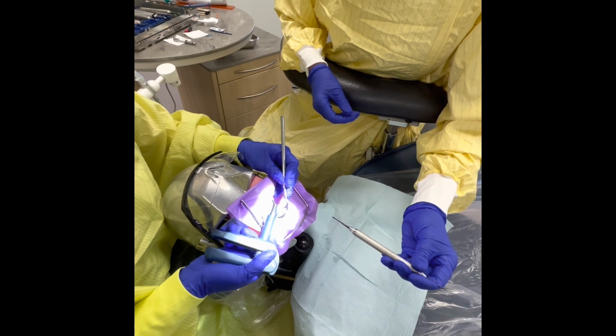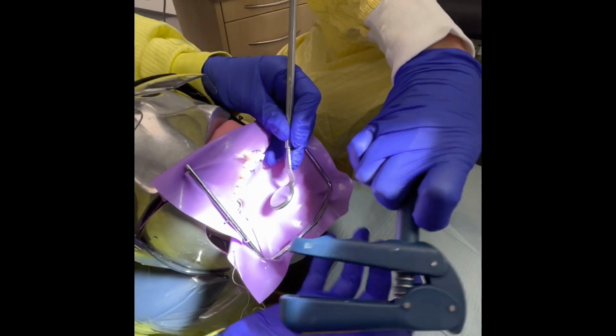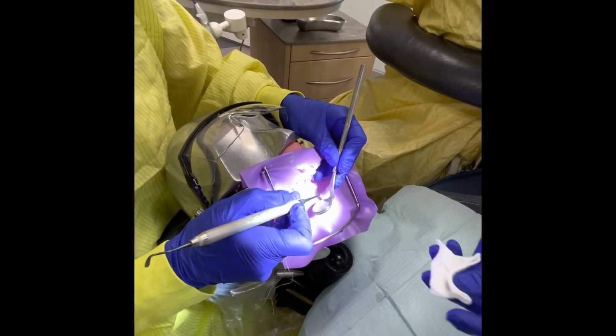The first instrument I'm going to pass her is a composite packing instrument. So you can see this end where it's a little condenser, but it's the composite packing instrument. I'm going to pass that to her first. Okay, and I'm going to pack my composite.